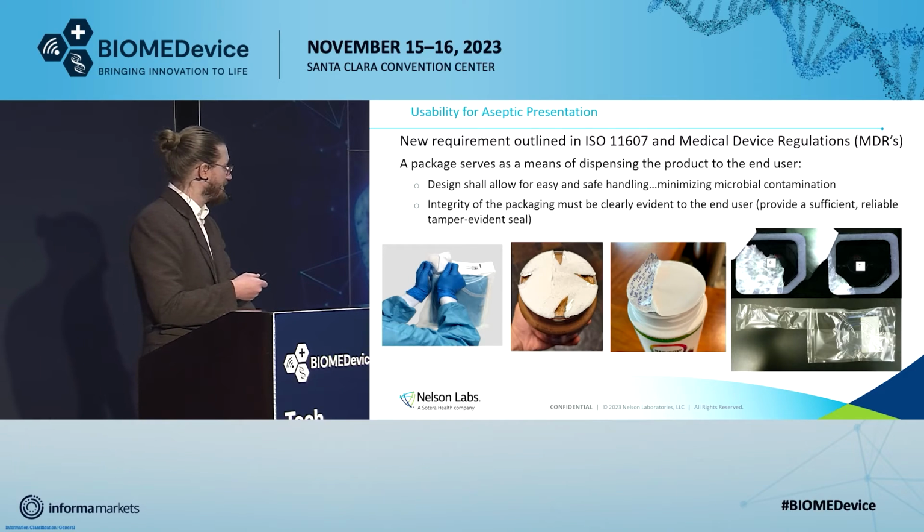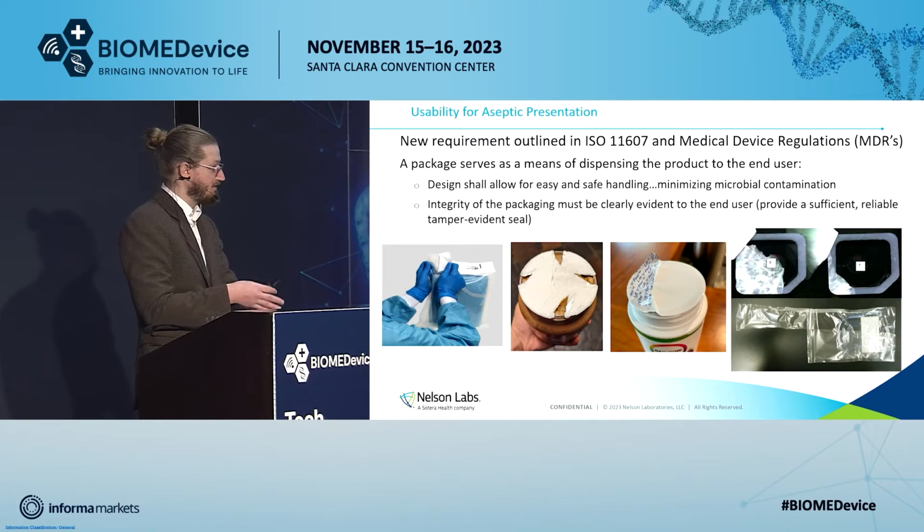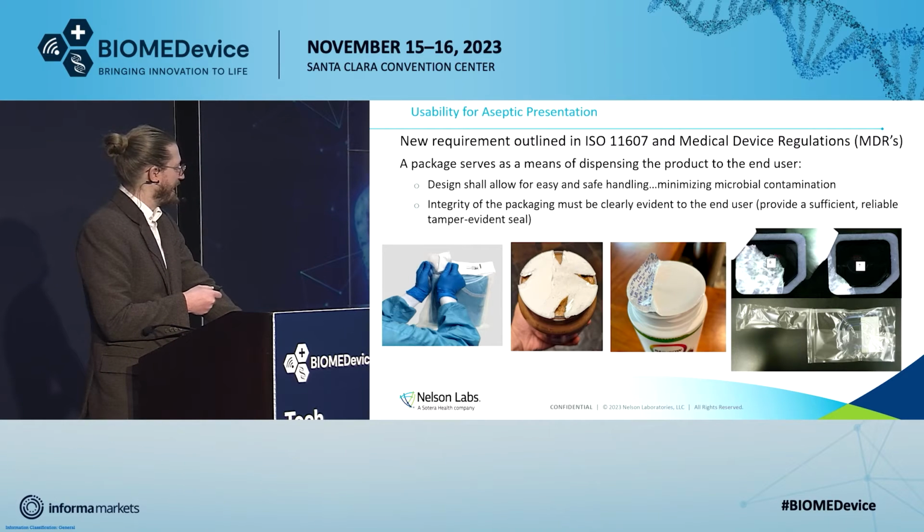There is a new requirement in ISO 11607. I say new, this has been in there since 2019 at this point, so it's getting to the point where it's not very new anymore. But there is an aseptic presentation requirement that's been added in there.